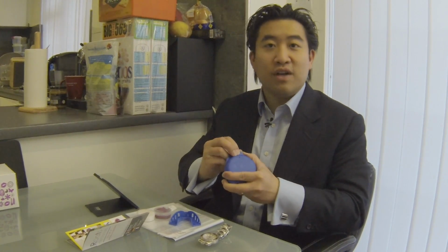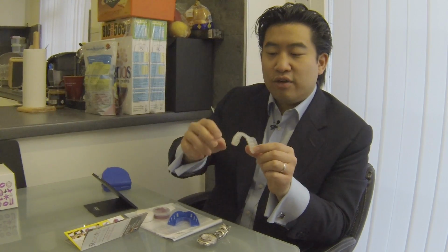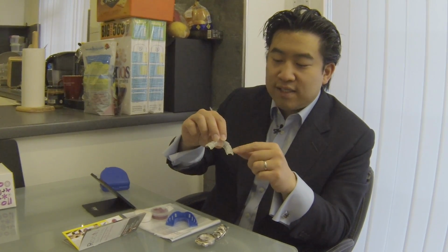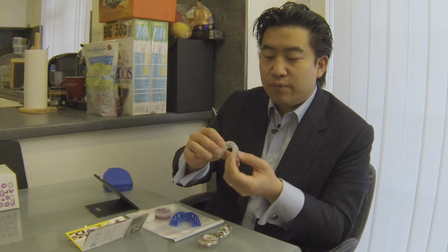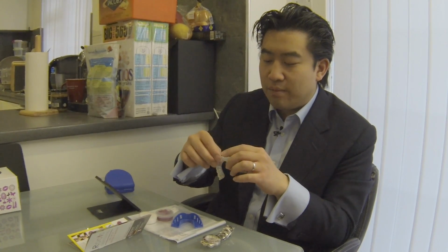So I've got one from last year. This is about 9 months old now, and this mouth guard, when it's brand new, comes very transparent and very see-through. It's old now, so it's yellowed a little bit. On the back here you can see some holes where I've ground all the way through, and that is when you know it's pretty much shot. As soon as you see one hole appear, the others appear quite soon after.